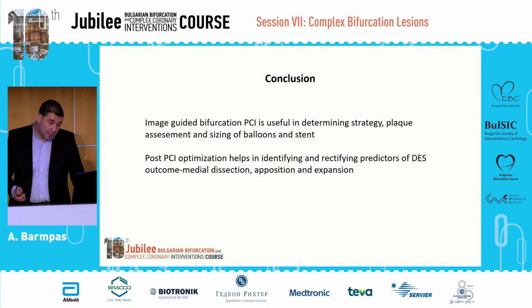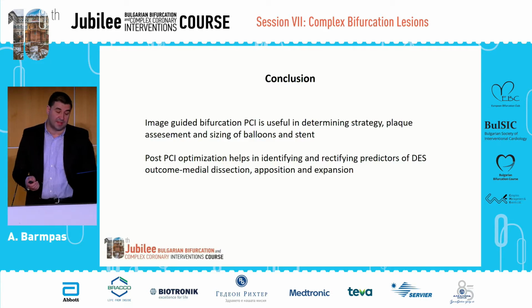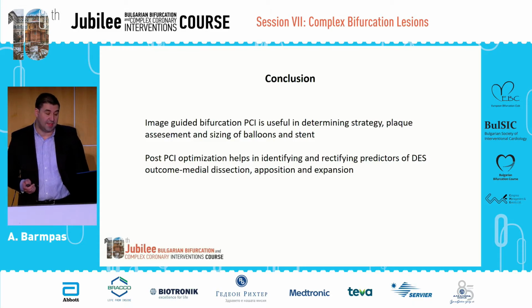I would like to conclude that image-guided bifurcation PCI is useful in determining strategy, plaque assessment, and sizing of balloons and stent. Post-PCI optimization helps in identifying and rectifying predictors of DES outcome: medial dissections, apposition, and expansion.